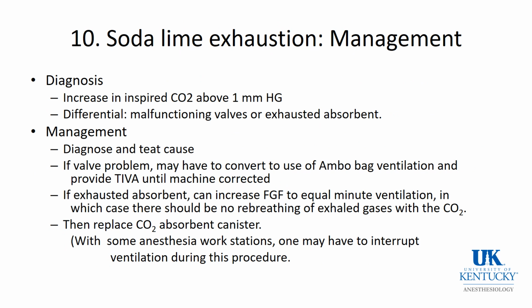Now, what to do about soda lime exhaustion? This was a key word. The diagnosis is made when you see the inspired concentration going up, and I've already talked about what to do about it, so we'll move on.